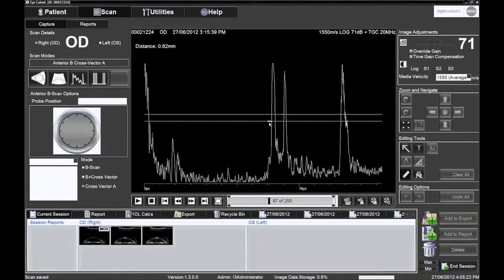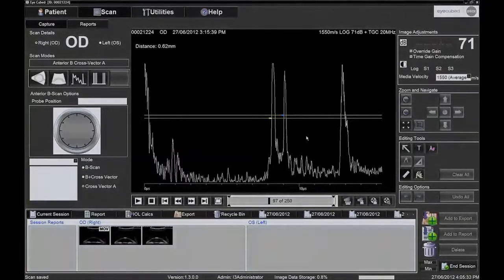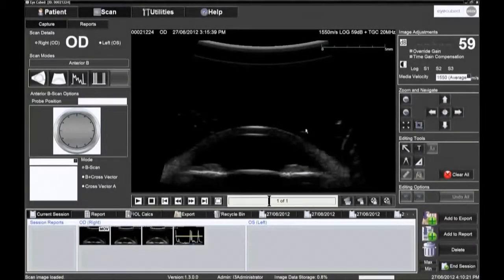Measurements can be made in millimetres using the editing tools. Move the markers to the appropriate echoes to obtain the distance between them. Other editing tools are available on the B mode image. It is possible to position arrows and text boxes for educational or referral purposes.